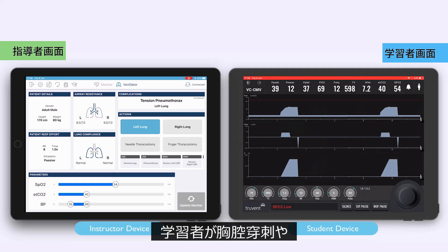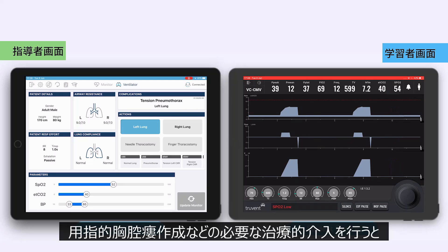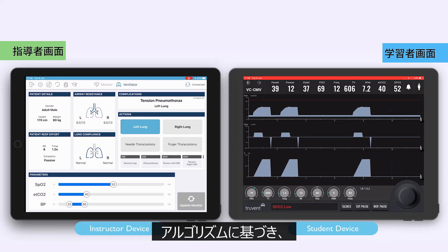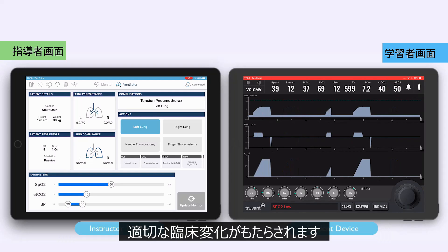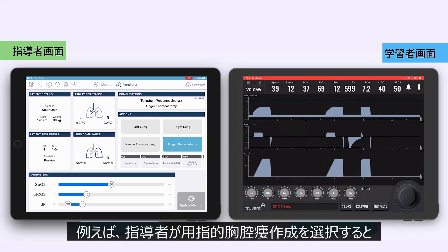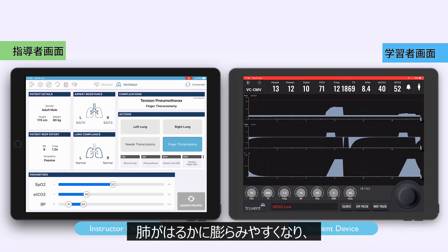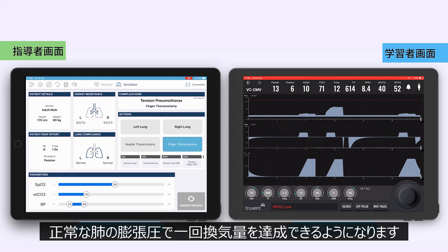When the student performs the necessary therapeutic intervention, such as needle thoracostomy or finger thoracostomy, this also leads to appropriate clinical changes from within the algorithm. For example, when the instructor selects finger thoracostomy, the lungs become much easier to inflate and the tidal volume can be achieved with normal lung inflation pressures once more.